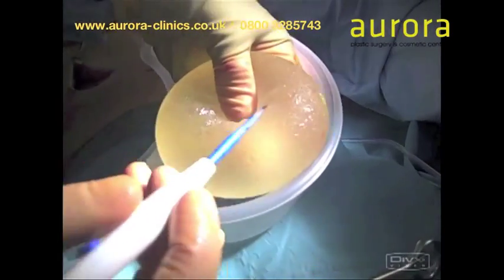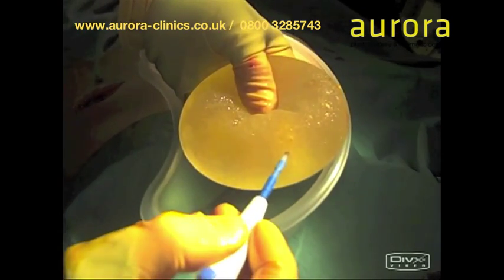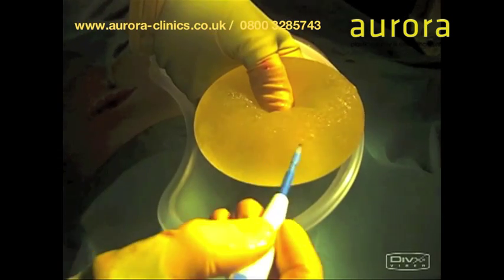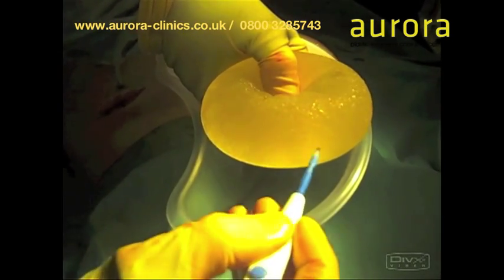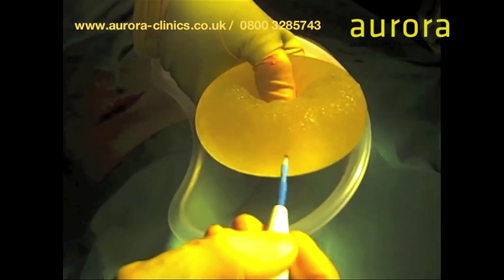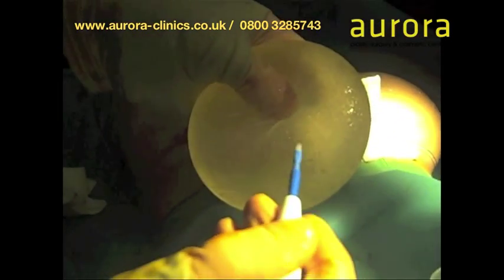If I just do a test here with the cutting diathermy, I'll put it on full. See, it will not cut — if I was doing that on the skin it would cut right through, but it will not cut. This will cut anything; however, if I used a knife on here I could go through the shell quite easily. So that's why we use cutting diathermy.